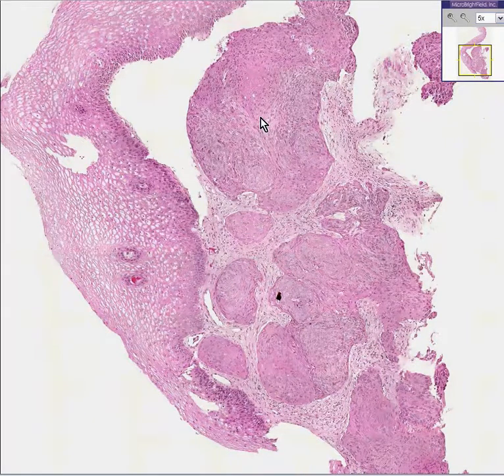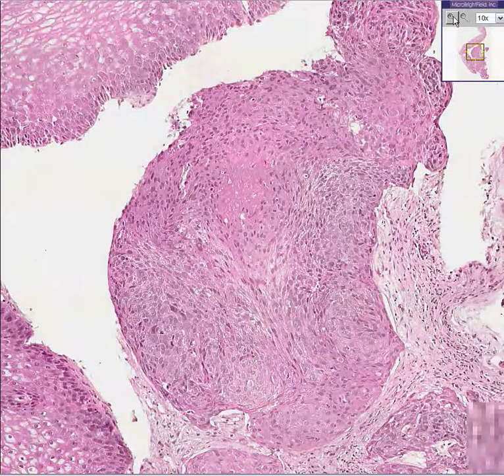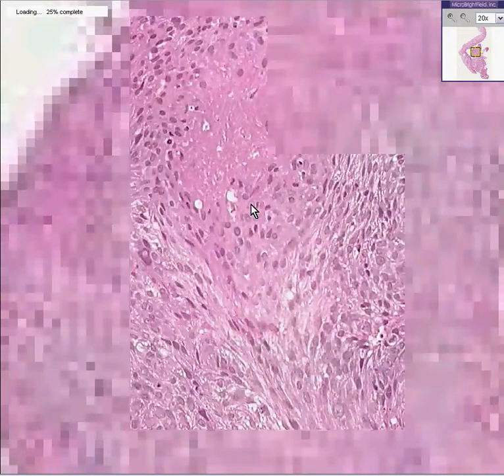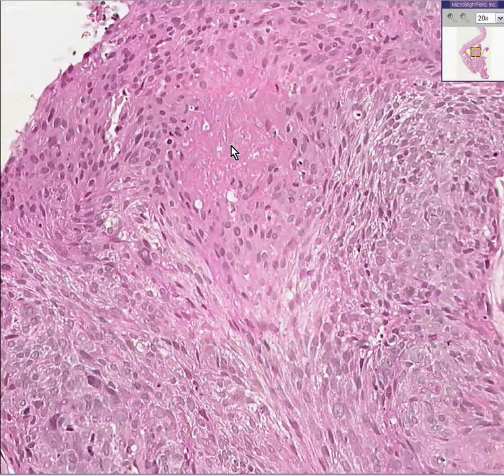Another feature that will be even more revealing is if you look closer at the nests of squamous epithelium, you will soon see that there are areas in which there is necrosis. And last but not least, there are bizarre nuclear forms, like here, like here, like here. And in addition, you can see a mitotic figure there, and possibly here. So this is totally unorganized, but keratin-producing nest of infiltrating squamous cell carcinoma.